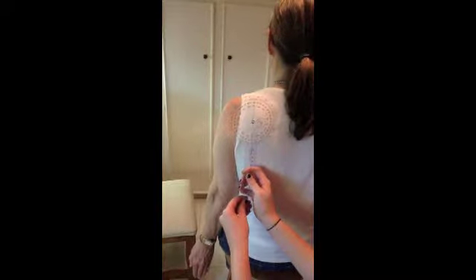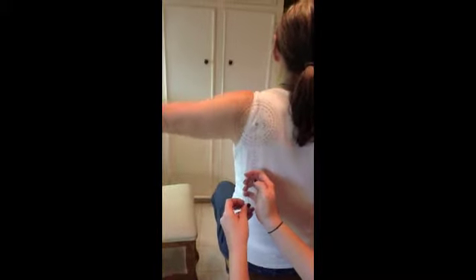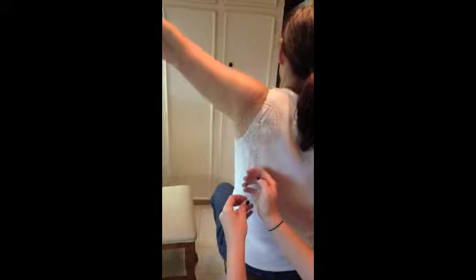For shoulder abduction, the subject is seated with the humerus in adduction and external rotation. The axis of the goniometer is on the acromion process of the posterior surface of the shoulder. The stationary bar is parallel to the trunk, and the movable bar is parallel to the humerus. The client's arm is raised to the side of the body in a frontal plane of movement. The measurement begins at 0 degrees and ranges to 170 degrees.